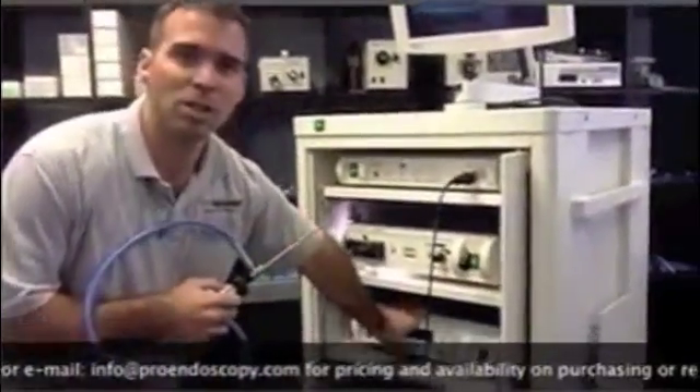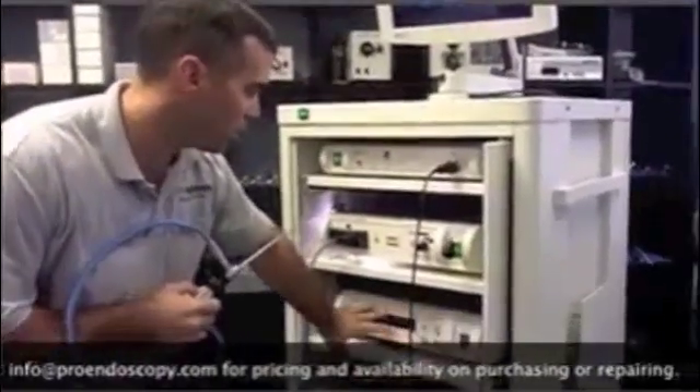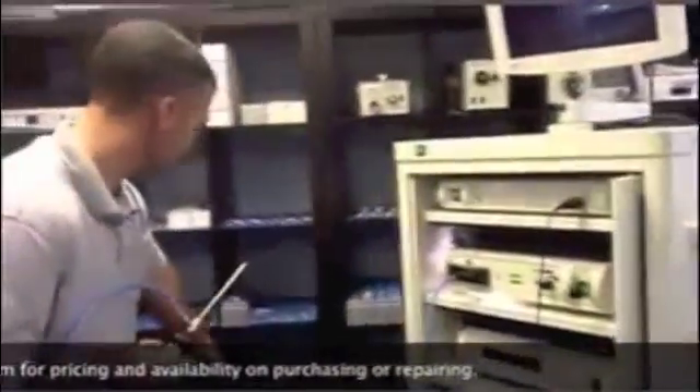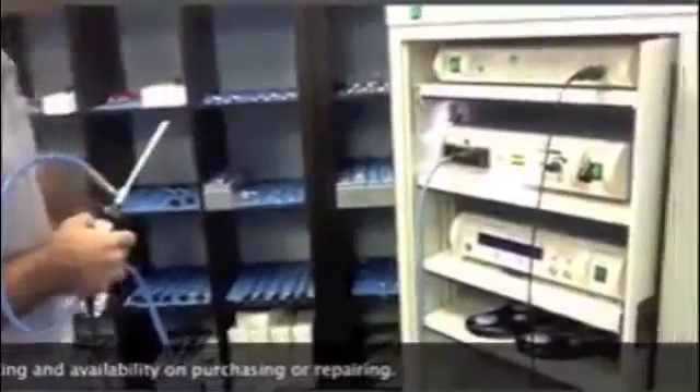You have your shaver, which they use in arthroscopy. You have your shaver system with a handpiece. You have shaver blades which we have down there. We did not hook them up but we have plenty in stock here.